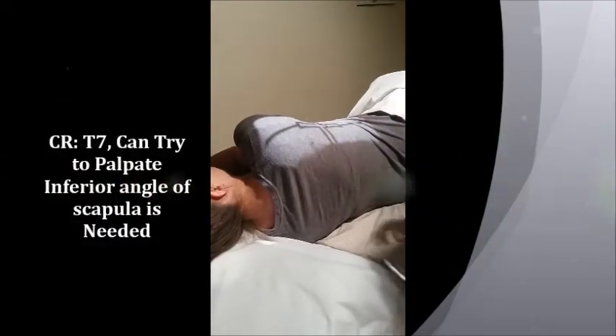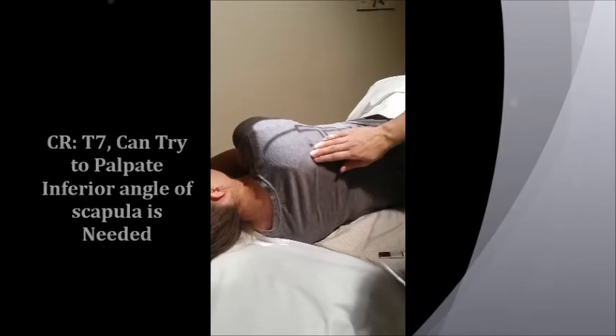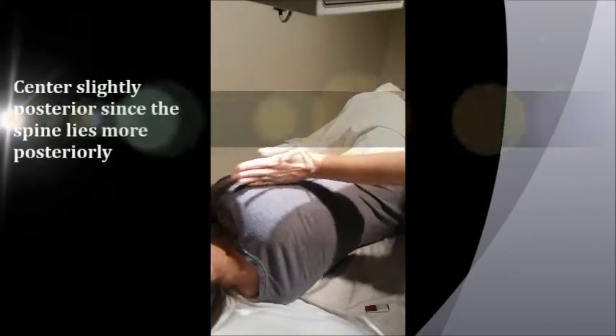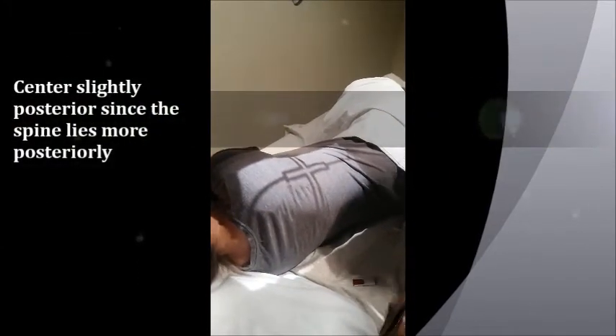Your centering point is really similar to your AP T-spine — it's at T7. If you want, you can palpate for the inferior angle of the scapula, about right there. I'm leaving it open top to bottom. I'm going to center not right down her midline — I'm going to be a little bit farther back so I'm not cutting off her spinous processes, giving a little bit of light just behind her.